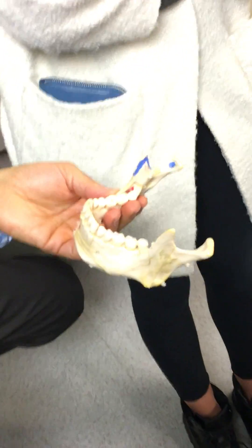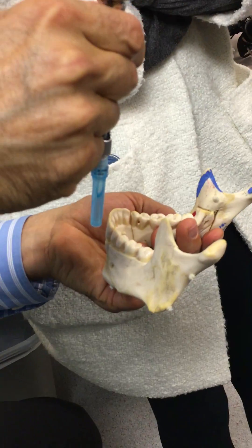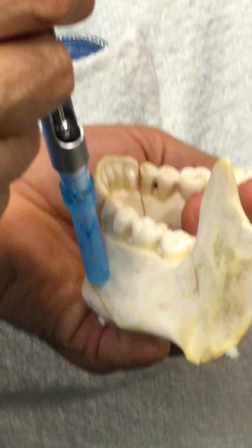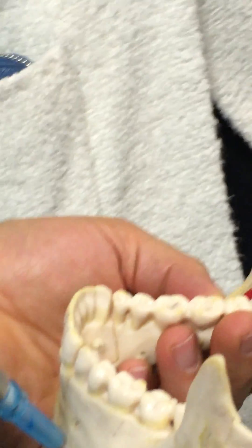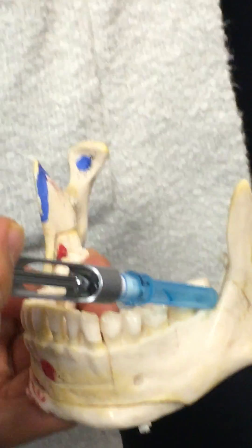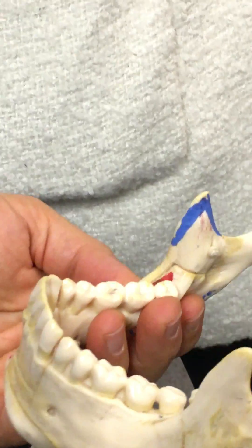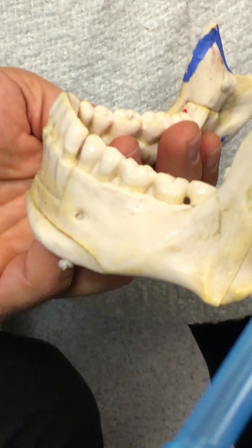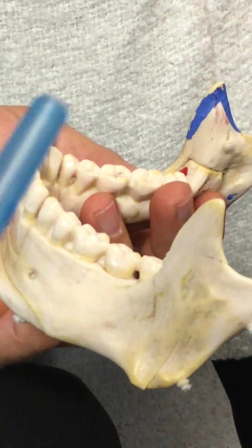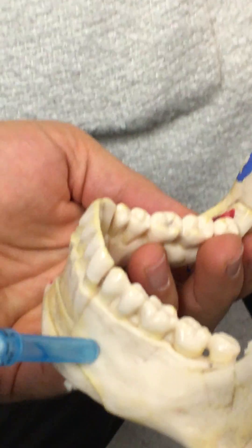So if I was going to give a mental block — there's the mental foramen right there. This is where you're coming into the vestibule, straight down, aiming the needle inward until you contact bone. You could be anywhere around this foramen. If you infiltrate this area, the local anesthetic is going to get into that nerve canal and track along and give you anesthesia. You always do it with the panoramic radiograph. You have to know where the foramen is — otherwise you're guessing. It isn't always exactly between the two premolars, and your success rates can be much higher if you know exactly where it is.